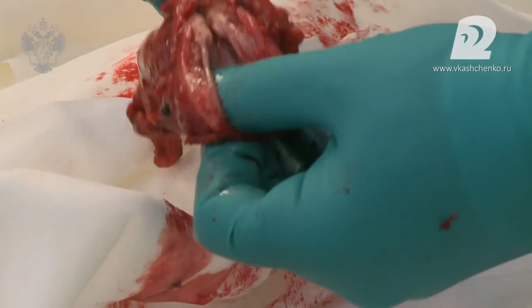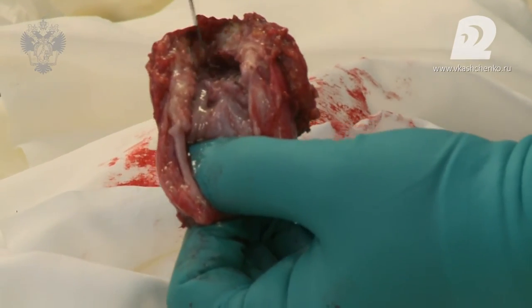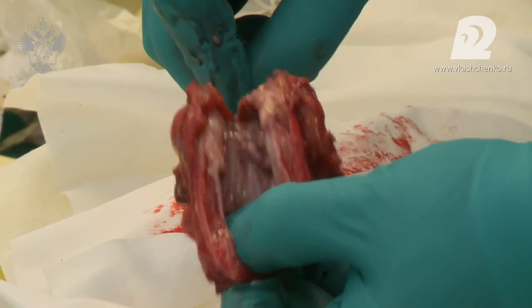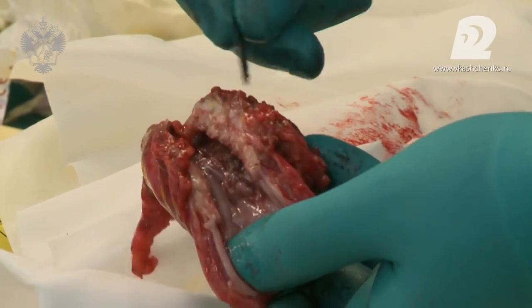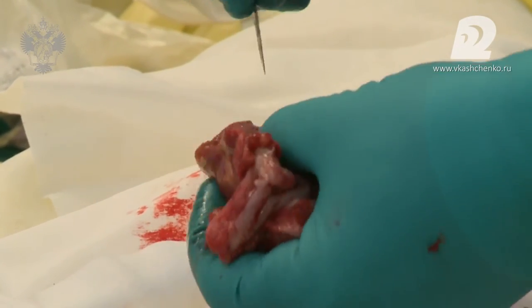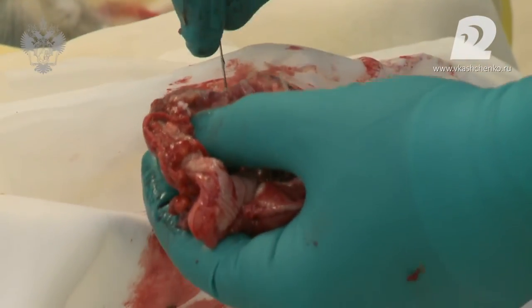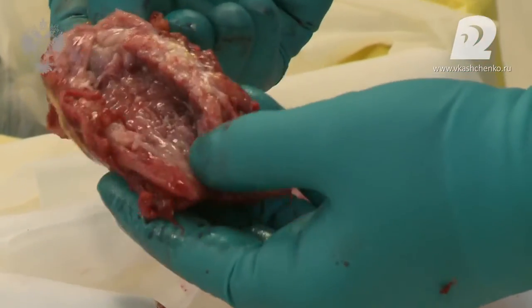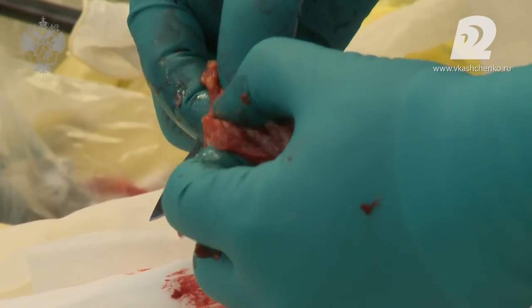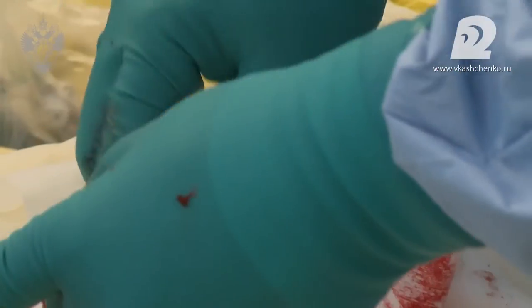Formally speaking, we do not have any penetration or ingrowth of the tumor signs, but the exophyte here is huge. Look, I'm dissecting it, and the endophyte growth is also there in the thickness of the wall. It is very evident in growth. Can you see it? Yes, we can see it perfectly well. Now, I continue dissecting, and you can see that the margin of the tumor is finished here in this area. You can see the upper margin. I already came up to the stitch, up to the suture.